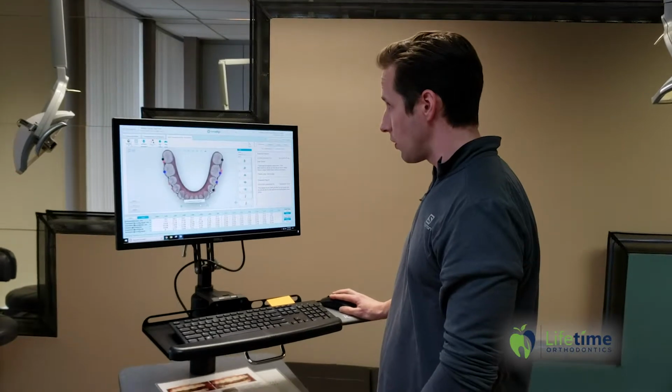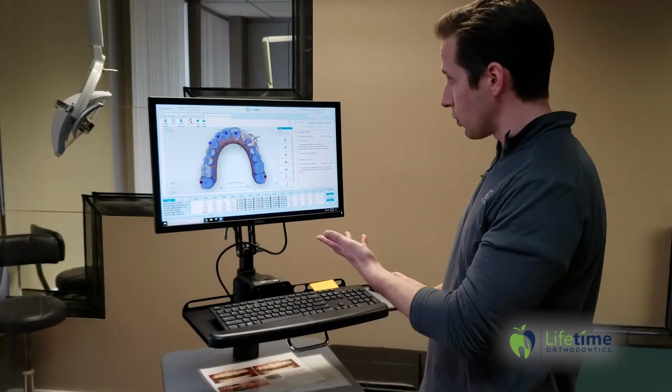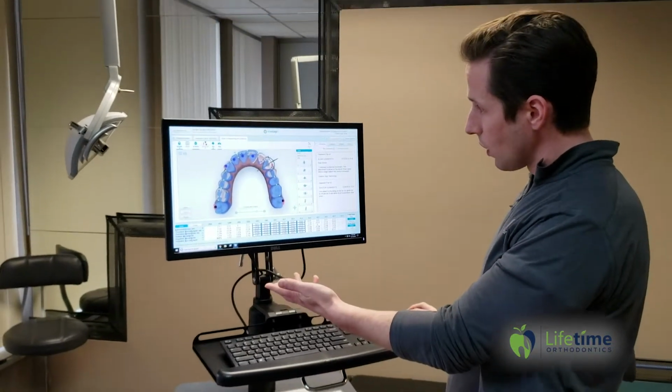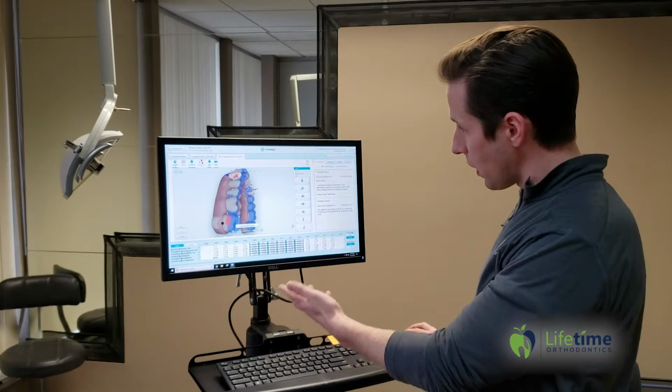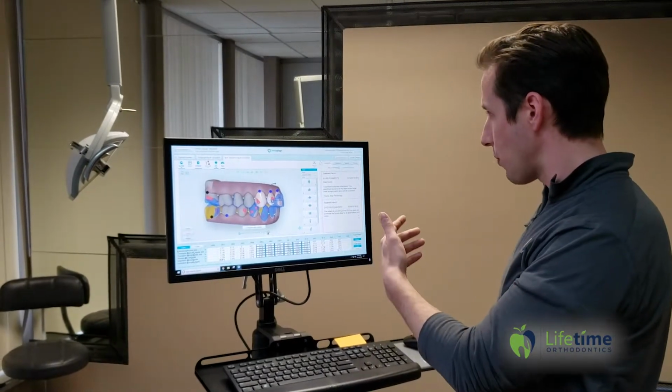As you can see here, the superimposition is cool. This shows me how the teeth are going to move. So the purple is where they start, and this is where they move. So it's not a lot of movement on these teeth. It's a lot of movement on these teeth in the back here, you can see. But there's not a lot happening, okay?